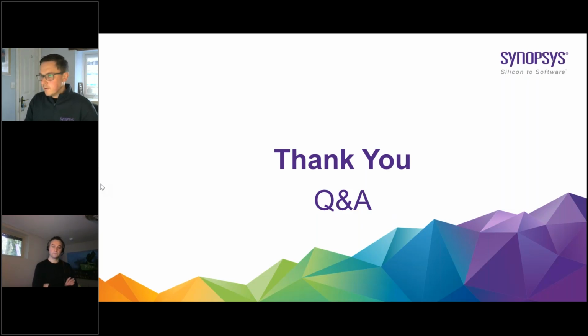So it won't kind of fail. It will just maybe not perform quite as well if it doesn't match the input data. Yeah. I don't know. You want to mention anything?